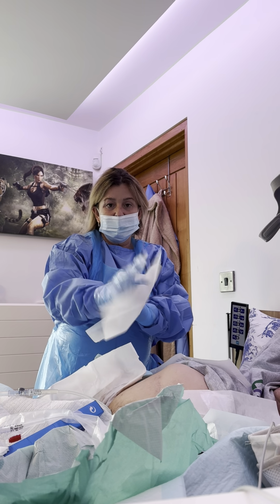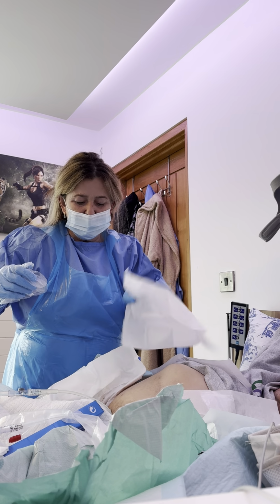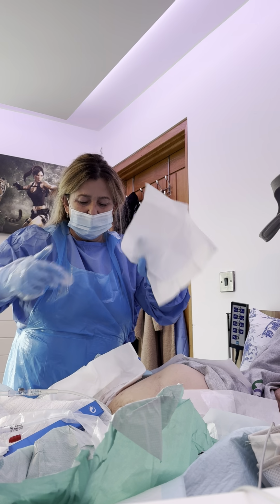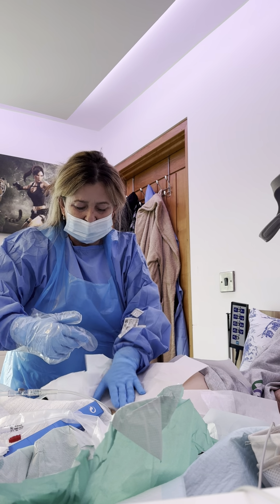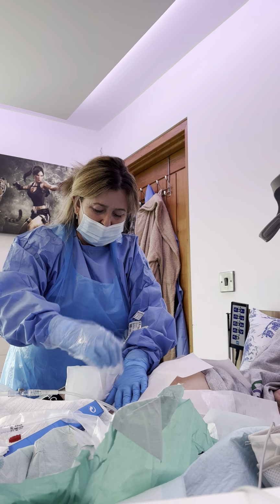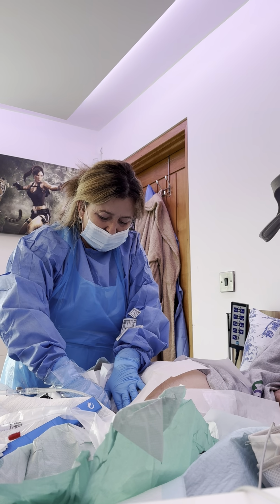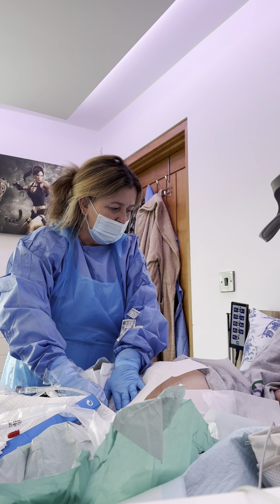This is my sterilised hand. This is my dirty one. So what you can do is use your sterilised pad there, open up, lift the tummy part up, and just take the catheter out. So take that, Ben, take a big breath.